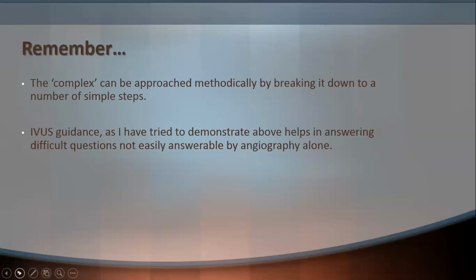IVUS guidance, as I have tried to demonstrate above, helps in answering difficult questions not easily answerable by angiography alone. And these are cases that you can take knowledge from, and take forward into more complex cases, left mains, CTOs, calcified lesions, and you can get far better results than you get by angiographic guidance alone. So I conclude my talk here.